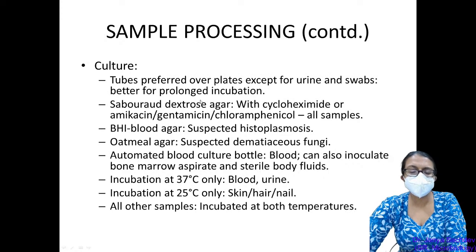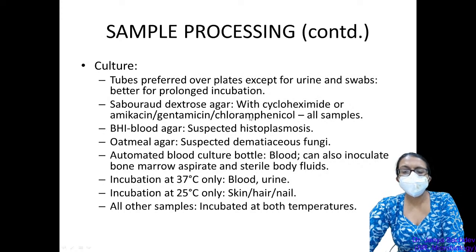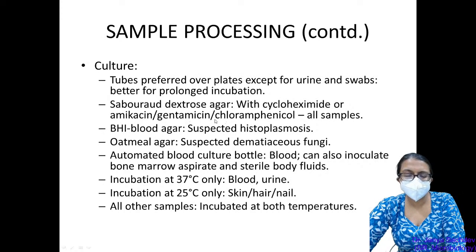So the most common media we use in mycology is Sabouraud dextrose agar. We usually add an antimicrobial like amikacin, gentamicin or chloramphenicol, which helps us to inhibit the growth of bacterial commensals.